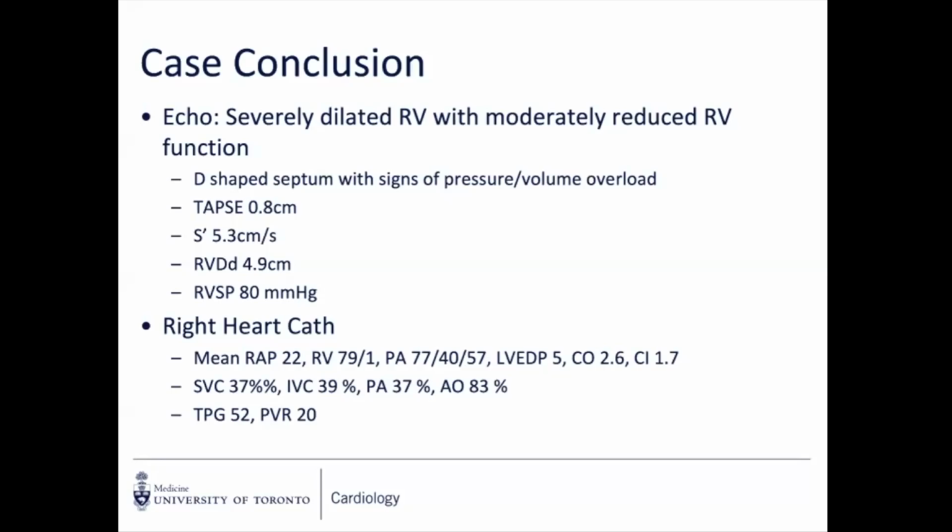Yeah, this is a young patient who's in ICU now. She's 31 years old, and she came in with dyspnea. They won't be able to hear you. Yeah, just talk a little bit louder. So this is a 31-year-old female who's in CICU now.